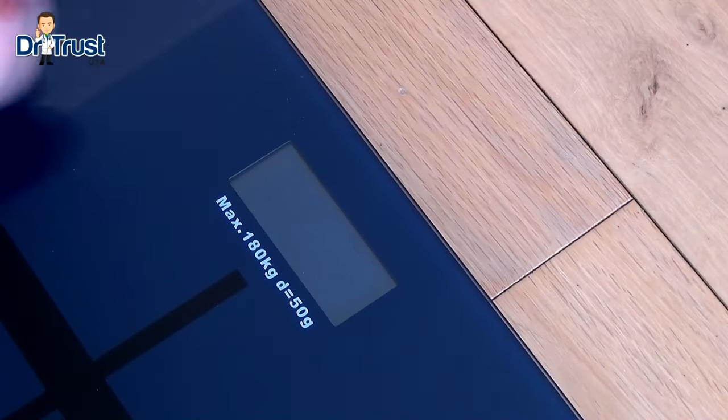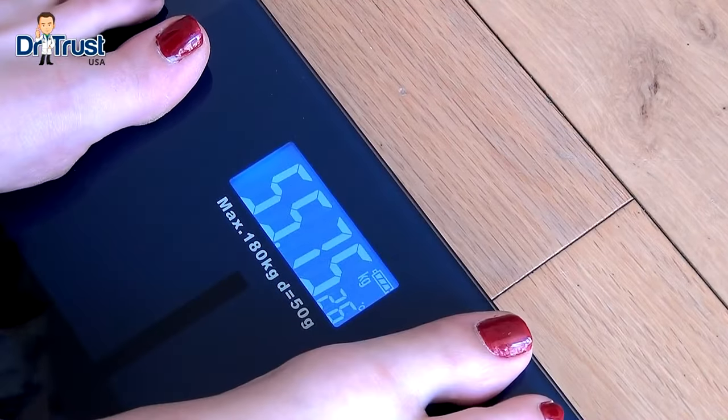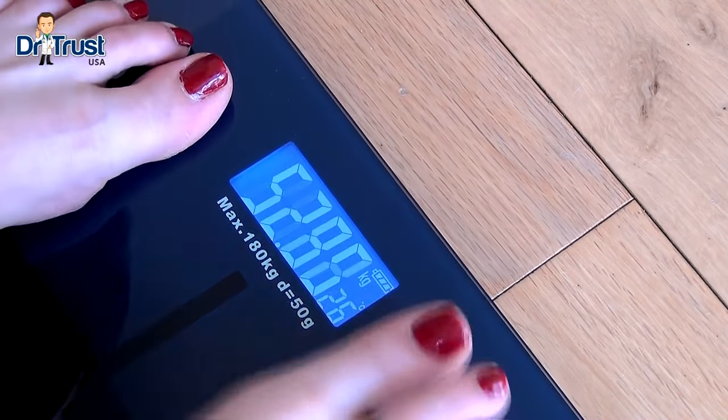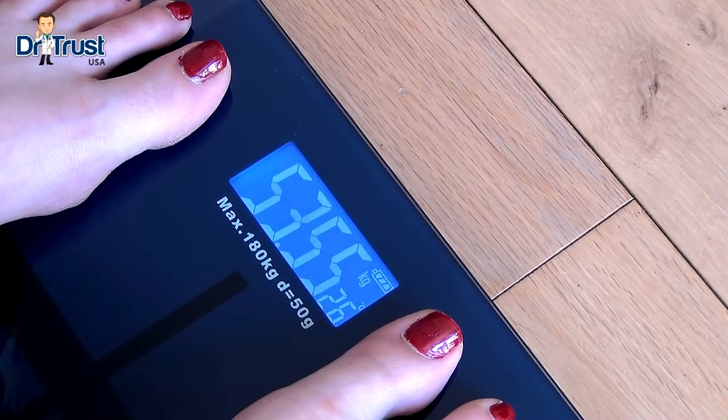Getting started is easy. Place the scales on a hard flat surface and step on and off again to initiate calibration. When the scales show C then 0, step on and stand still with your weight evenly spread across both feet. The display remains steady when an accurate measurement has been taken.